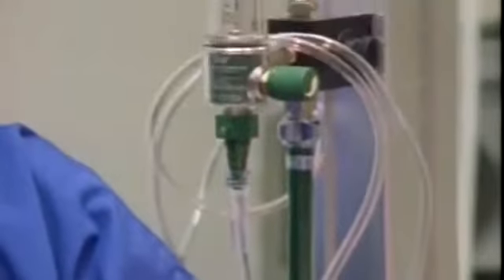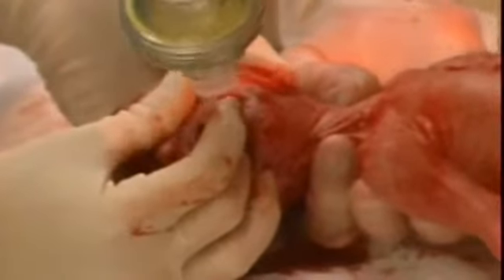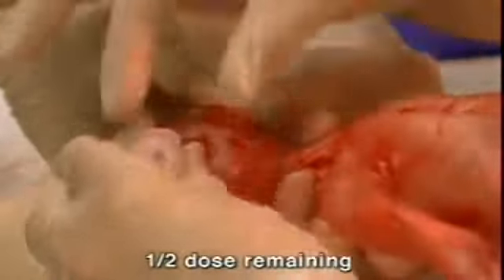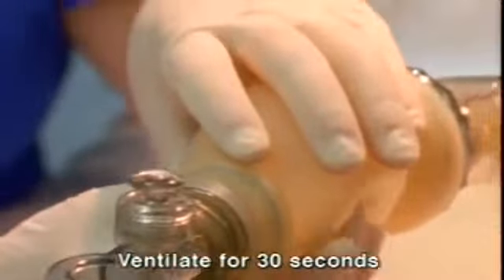Ventilate for 30 seconds after each fraction to distribute Surfactant. The ambu bag should be capable of delivering 100% oxygen to prevent cyanosis and should provide adequate air exchange and chest wall excursion. Next, rotate the infant so that the head and same shoulder are slightly up. Inject the second fractional dose. Again, ventilate for 30 seconds.